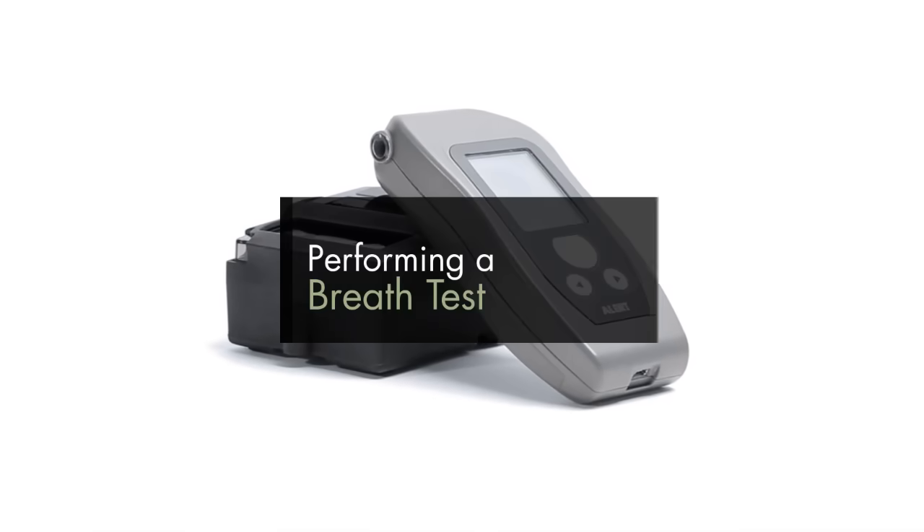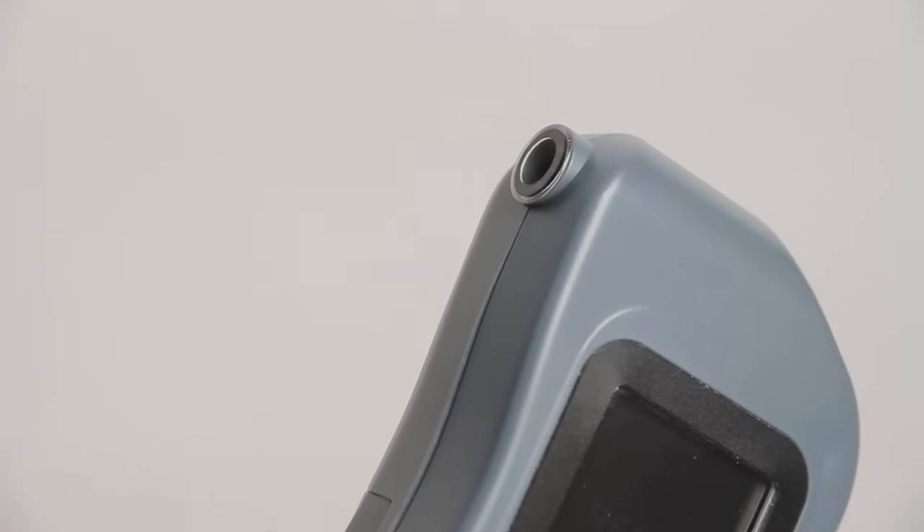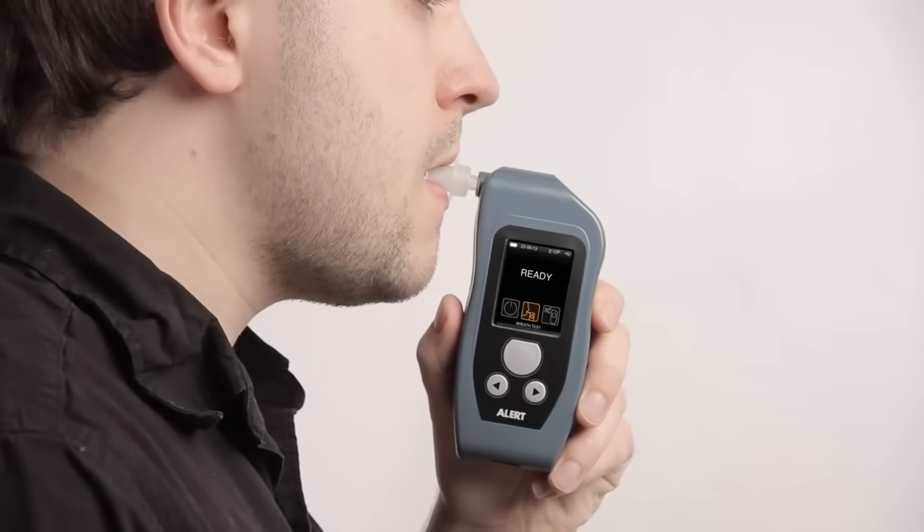Performing a Breath Test. Select the Breath Test icon to perform a breath test using a mouthpiece. Always insert a clean mouthpiece to ensure an accurate breath sample. Preparing for test is displayed, followed by Ready. Blow into the mouthpiece for 5 seconds.